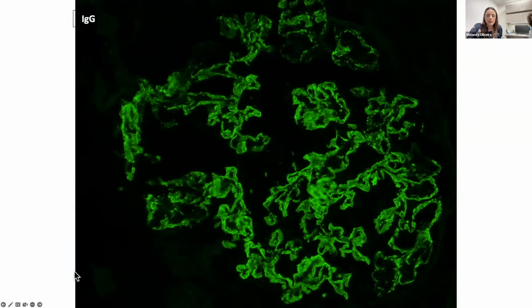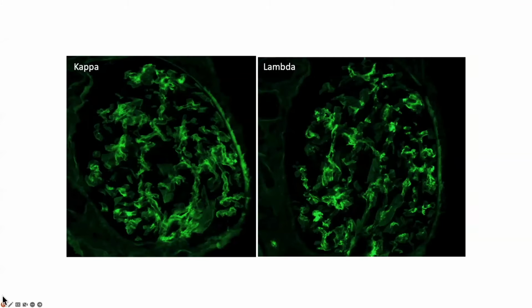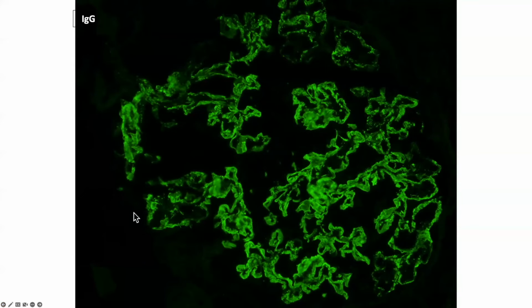Okay, so here we have immunofluorescence staining for IgG that appears to be predominantly in the capillary walls. I wouldn't describe it as granular appearing. Yeah, in some areas it looks granular, and in other areas kind of band-like where it's more confluent. Sometimes when it's full of deposit, it becomes not true linear, but more band-like. Up at 1 o'clock, you could see it's more granular in that area.